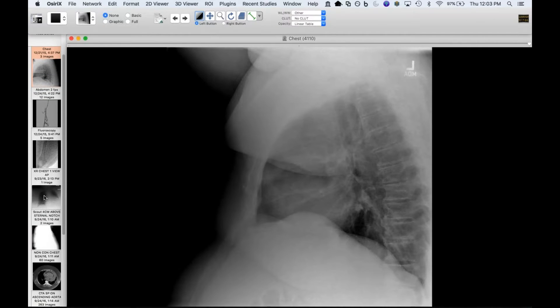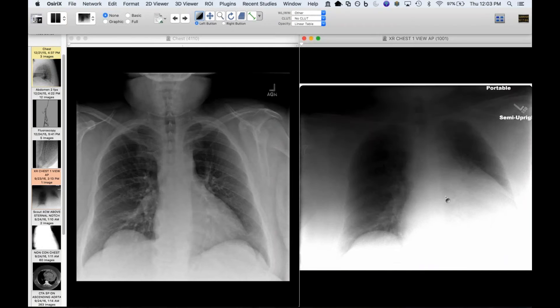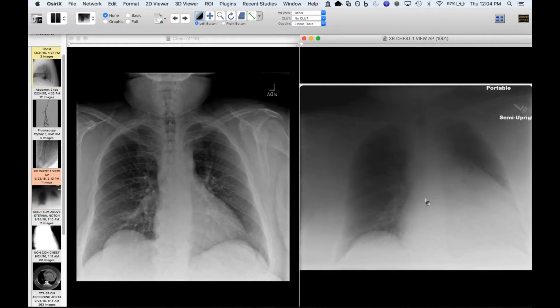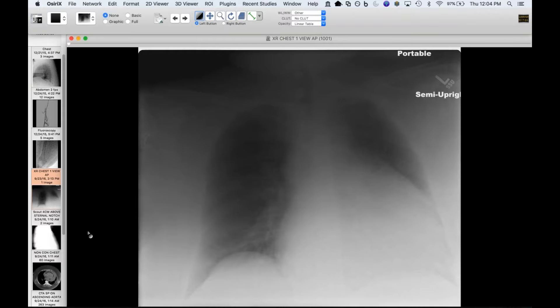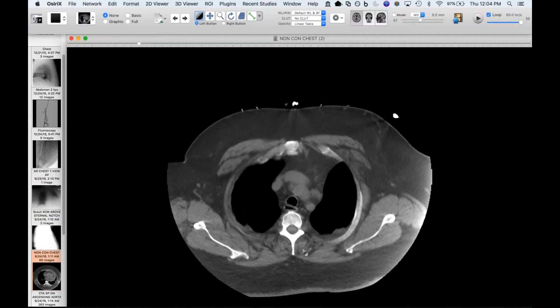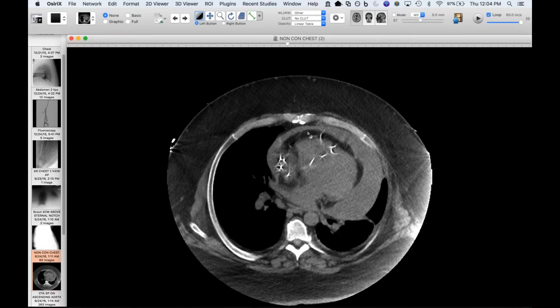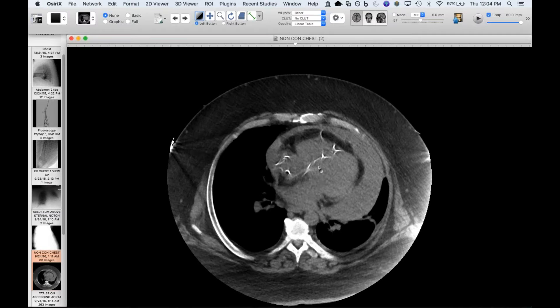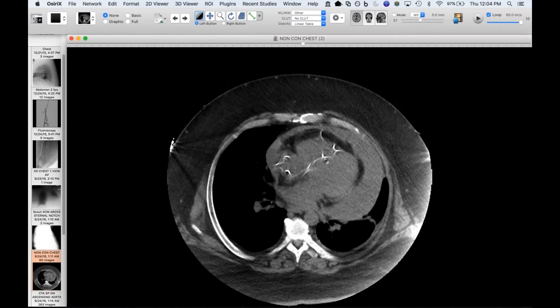He came in about a week ago on this radiograph. It's a portable radiograph and he's a big guy, but I don't think we can say his heart is larger just because of technique — he's got a much larger cardiac contour. In the acute setting you worry about pericardial effusion. You can even see it on the thumbnail. This is hemopericardium — very high attenuation. And there's an interesting metallic wire in his RV. Credit to one of my second-year residents who saw this on call and identified that it was actually going through the RV and causing an RV perforation.